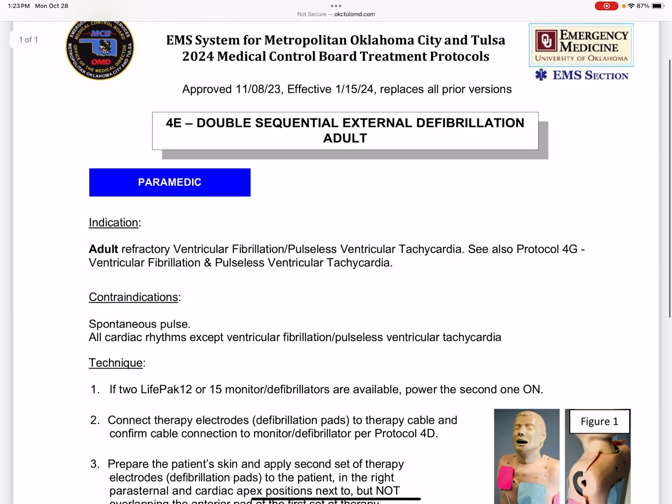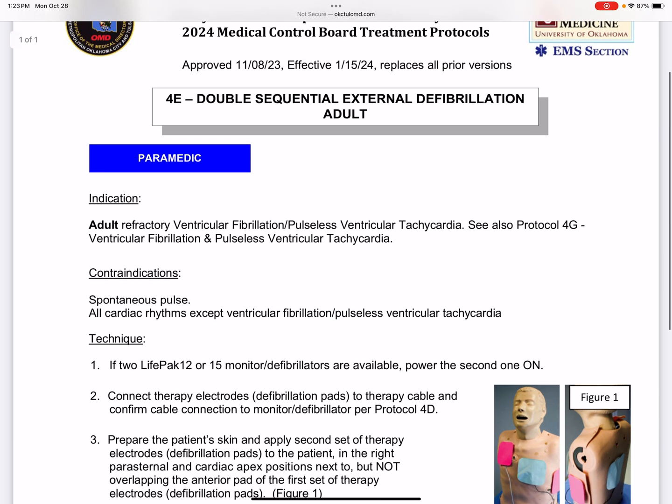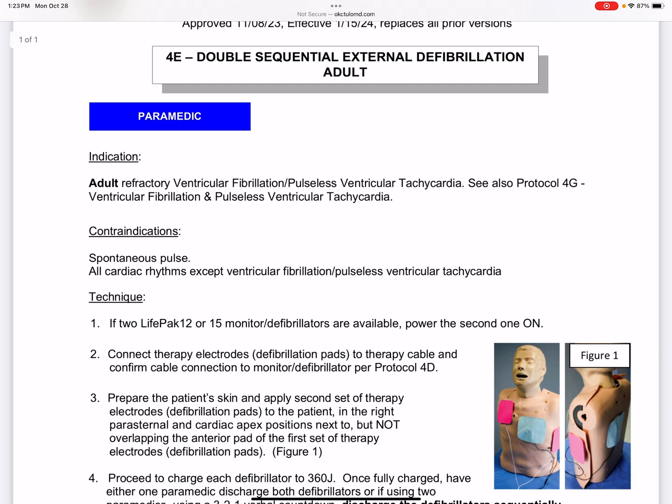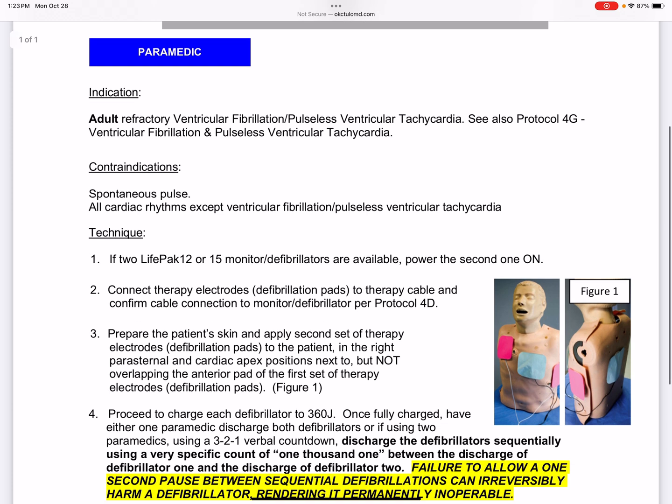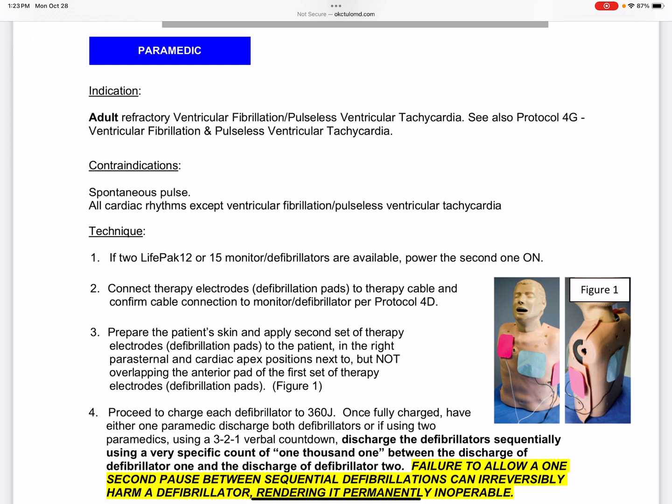So here is section 4E. It's the double sequential external defibrillation, adult. If you've never done this before, it might seem kind of crazy, but it works really well. We've been doing this for several years now. Just if you have never done it, make sure you read through this after you watch this video and make sure you fully understand it.